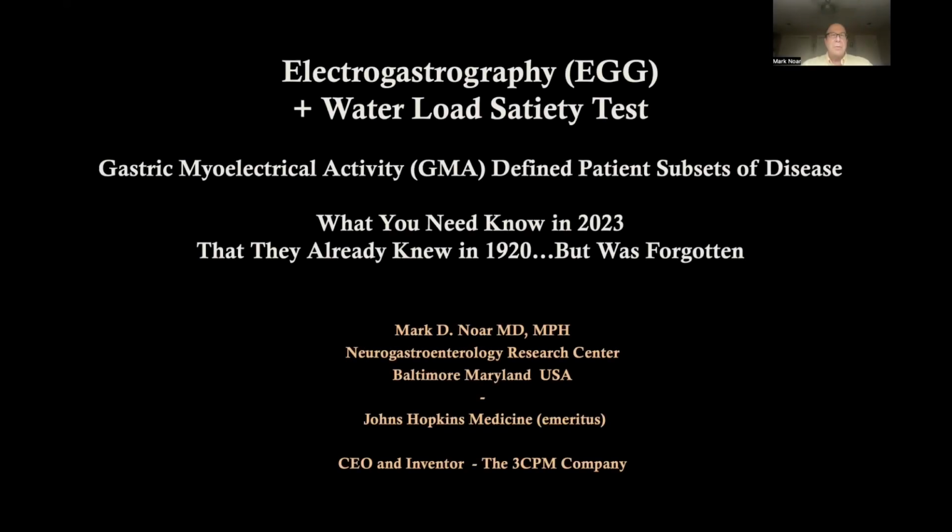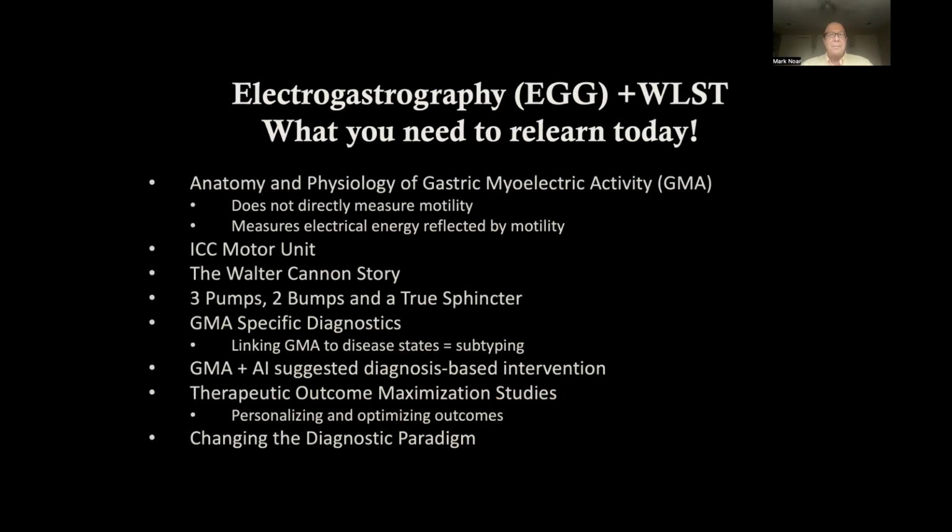Today, I'm going to talk to you about electrogastrography and the water load satiety test, especially as we use this to define gastric myoelectrical activity, which then defines patient subsets of disease. I want to especially cover some new developments. In other words, what you need to know in 2023, which is actually what they already knew in the 1920s, but were unfortunately forgotten. Today, we're going to look at what we need to relearn.